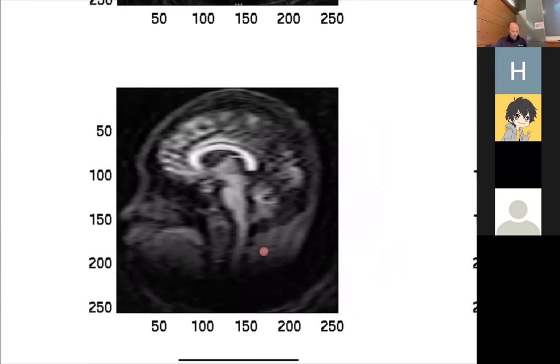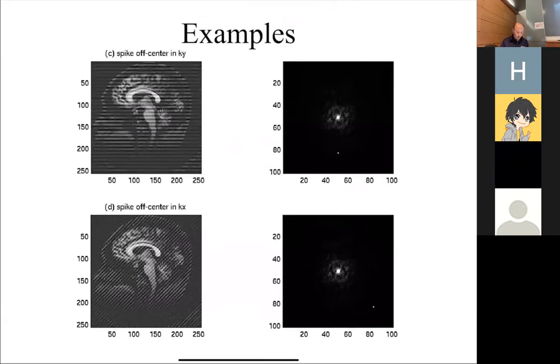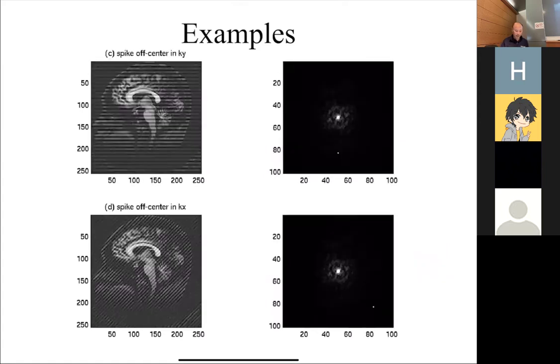Here, let's look at this image. See that edge here, which used to be nice and sharp? It's all blurred out now, because I've lost a lot of the detail. Whereas this edge here is still pretty sharp. The horizontal edges are still pretty sharp. And there are other examples in the supplementary lecture that you can look at.